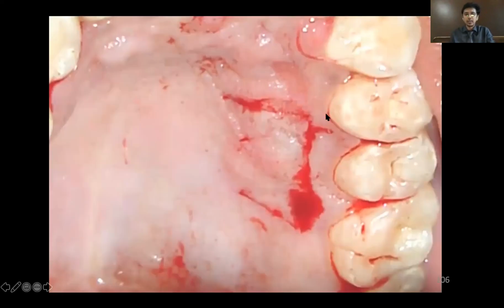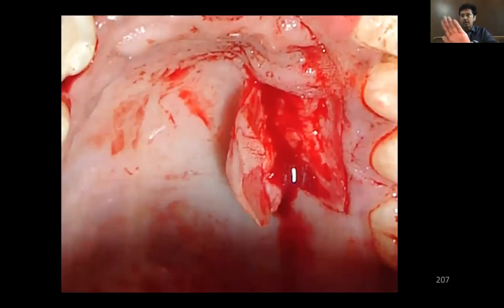With regard to the connective tissue graft, those of you who are periodontists already know, we give a vertical incision deep till the depth of the bone, till your blade hits the bone. We give two horizontal incisions superficially, only 0.5 millimeter deep, 0.5 to 1 maximum, till the thickness of the epithelium, only till the bevel of the blade. Then we raise the flap.